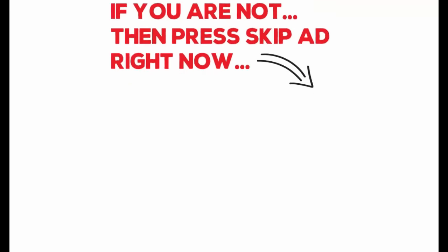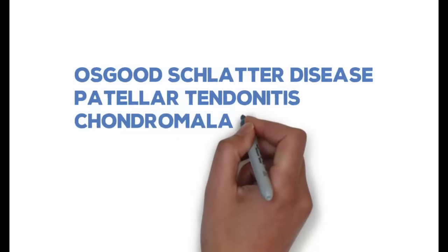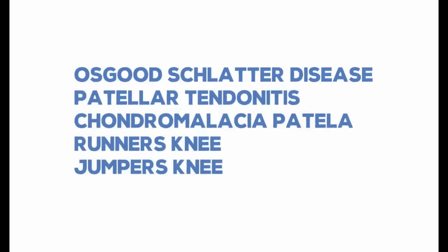Are you having problems with Osgood-Schlatter Disease, Patellar Tendonitis, Chondromalacia Patella, Runner's Knee, or Jumper's Knee?